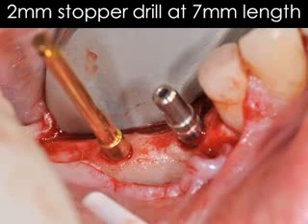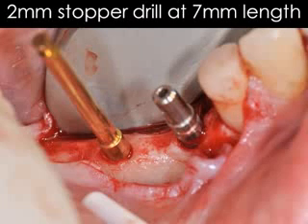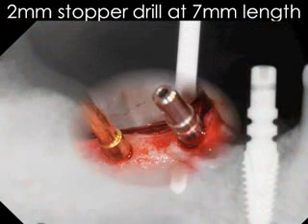Again, the 2 millimeter stopper drill at what length? 7 millimeter length. Should just note where we are, take an x-ray, and so forth. We're going to proceed with the case.